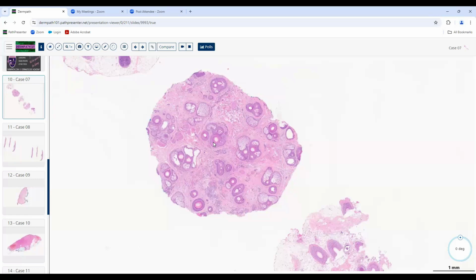It doesn't just respect the follicles itself, whereas lichen planus targets only the follicles. Discoid lupus erythematosus generally gets mostly the follicles. We can get inflammation between the follicles. And then the non-inflammatory alopecias, things like traction alopecias, they're scarring just around the follicles there.